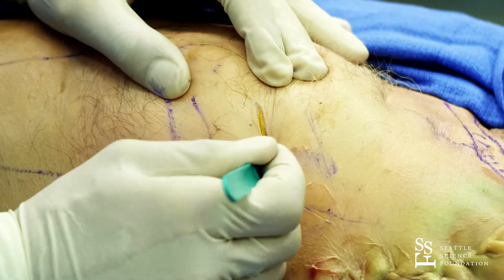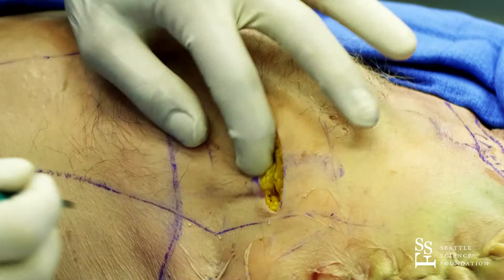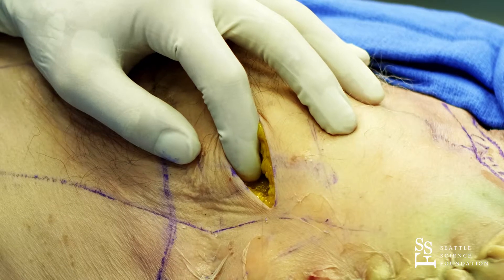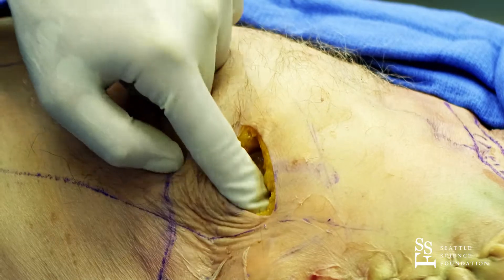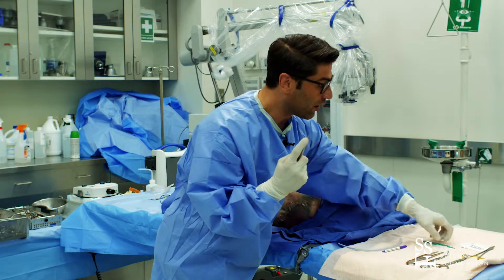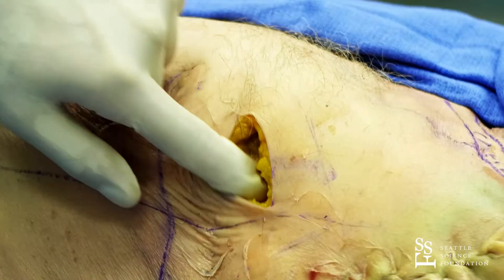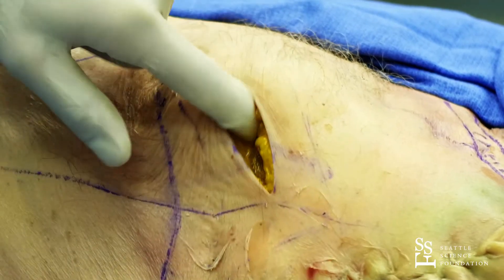I will do it on purpose a little bit larger than usual. Here you see the subcutaneous tissue. I sometimes use a Metzenbaum scissor but just the tip of it, because it's very dangerous — the worst case scenario is going with a sharp device like the trocar of a chest tube or the tip of your scissors into the chest cavity. You can really hurt the liver, the lung, or the heart, and that shouldn't happen.